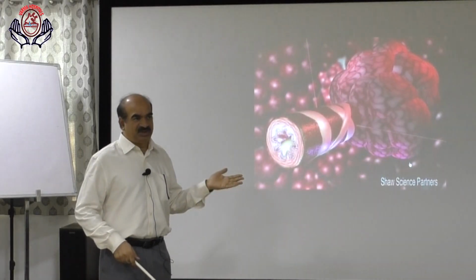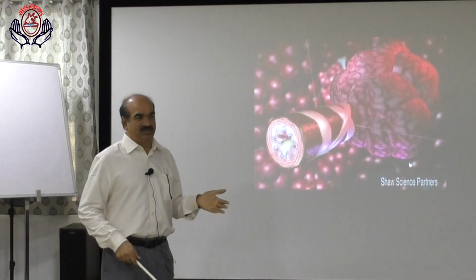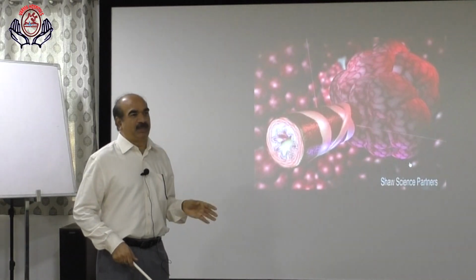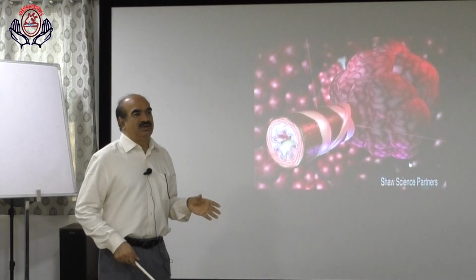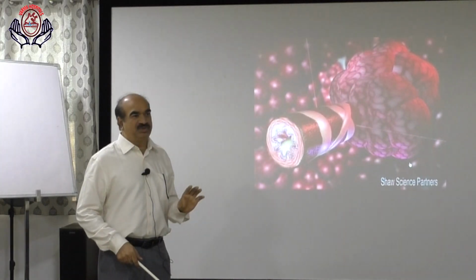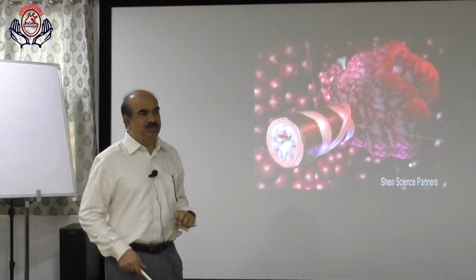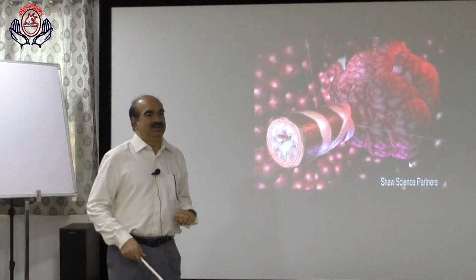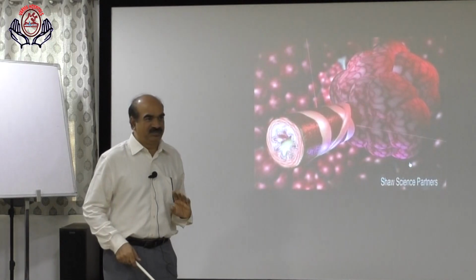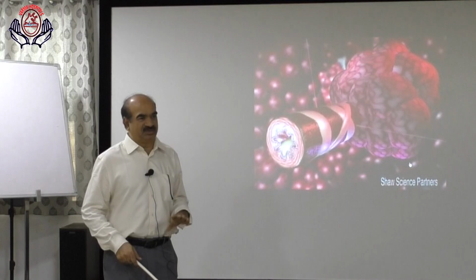In a conscious patient, if there is oxygenation failure, we will give NIV. We will try non-invasive ventilation with CPAP. What is CPAP? We will provide positive end expiratory pressure, that is PEEP. What is ZEEP? ZEEP is zero end expiratory pressure. Physiologically, end expiratory pressure is 0, that is ZEEP.